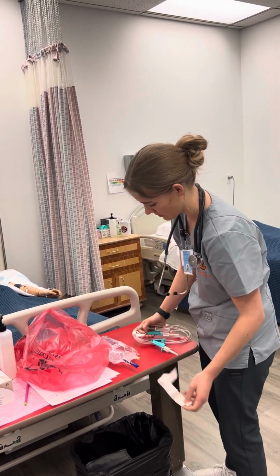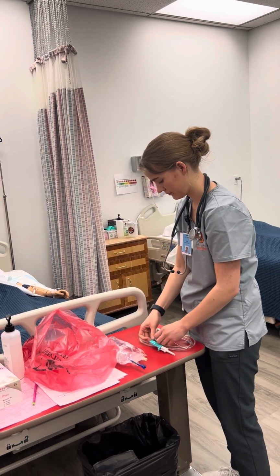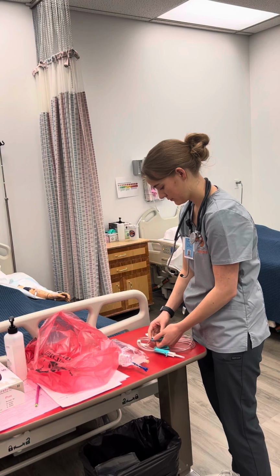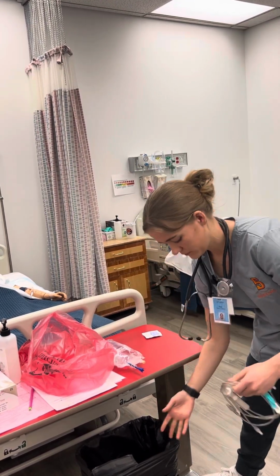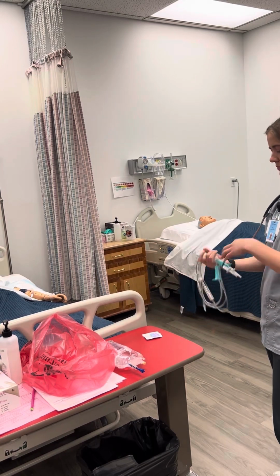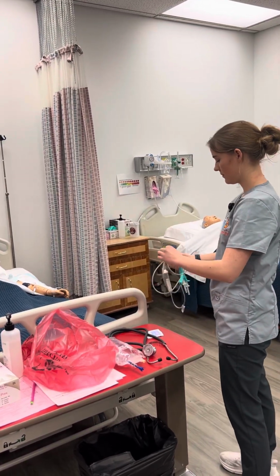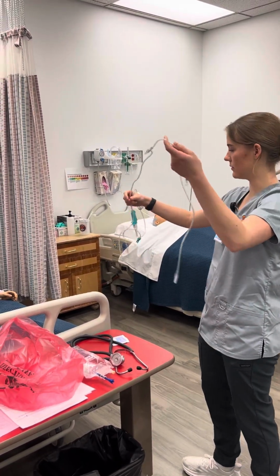Clamp everything. Just try not to jump on the floor.